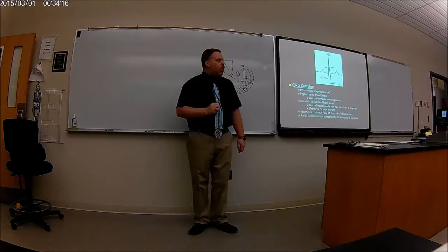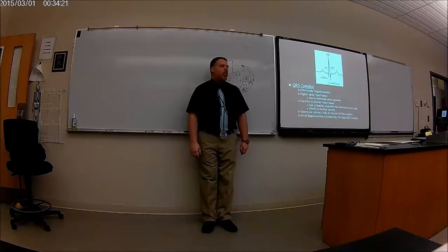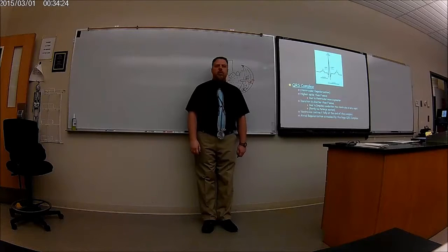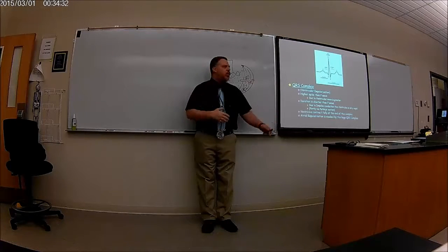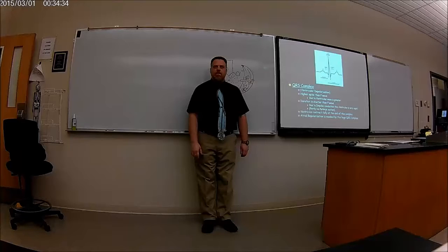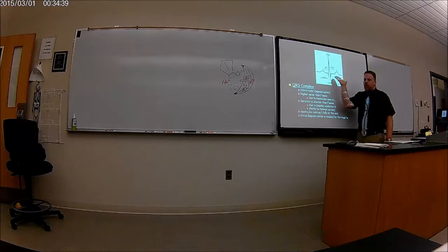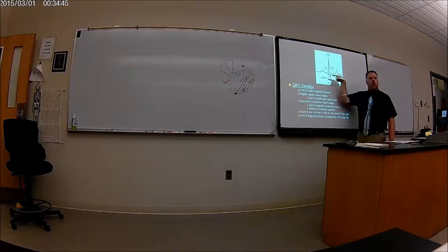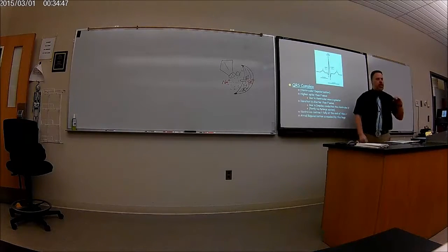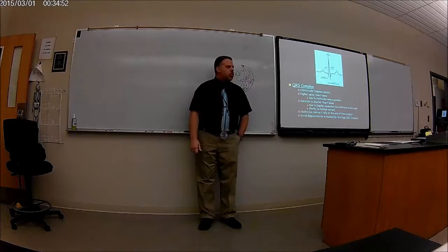Now, during the QRS, this is also the time when the atria relax. But you can't see it on an EKG because the massive thickness of the ventricles has masked this area. So you just see on here the ventricles contracting, but in there too is where the atria relax. You would normally see some sort of wave there. You can't because they're thin compared to the ventricular walls.